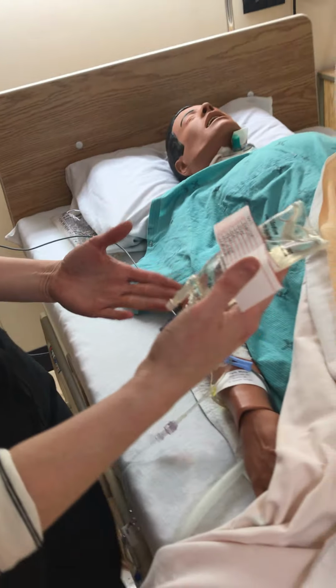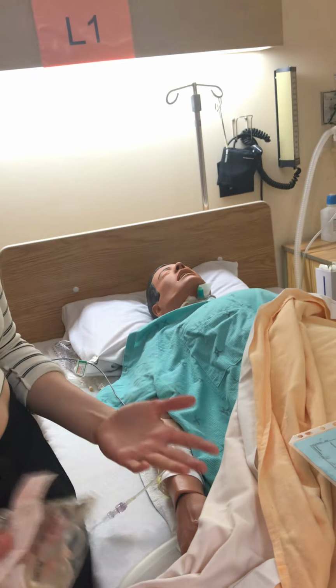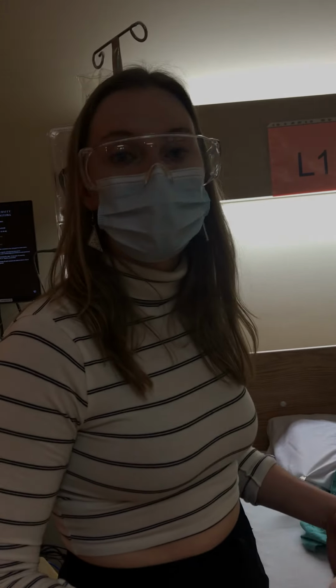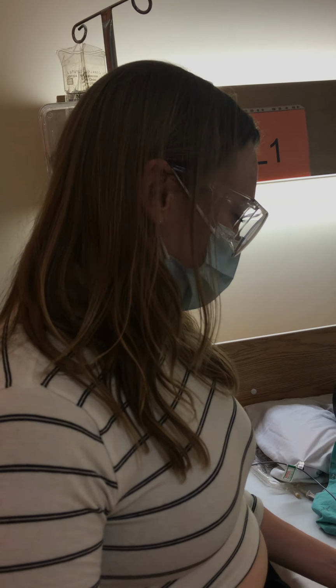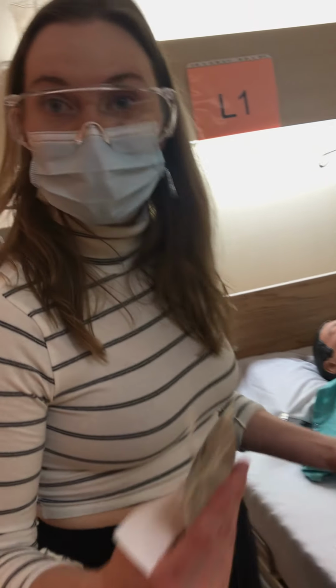So I just wanted to tell you that it might cause signs or side effects such as respiratory depression, nausea, fatigue. It might cause a few different things, and so I'm going to be monitoring her closely. I'm going to make sure she understands what she should be looking for and what she should tell me. If she feels weird at all, she can call me. And then I'm asking the patient if she is okay with me giving her the medication, and she is.